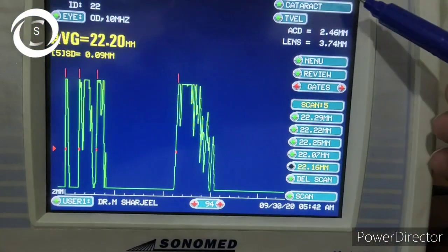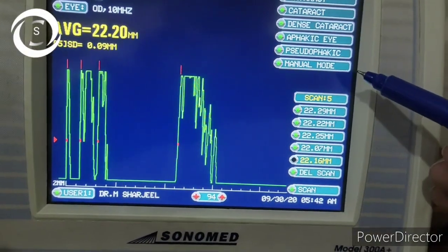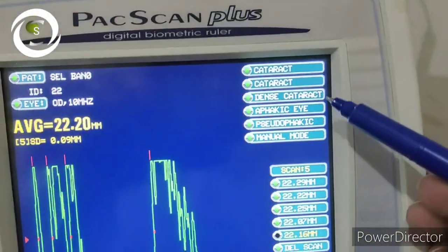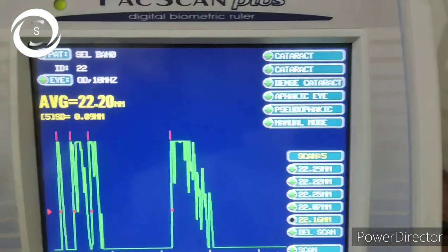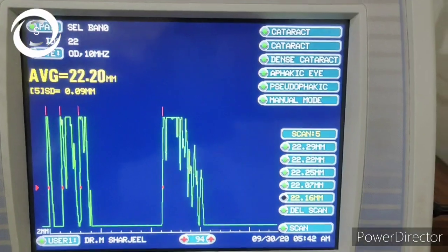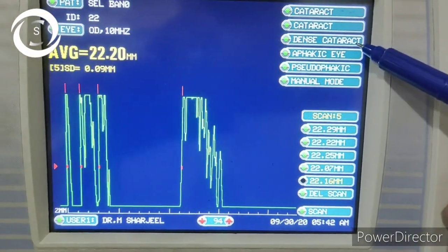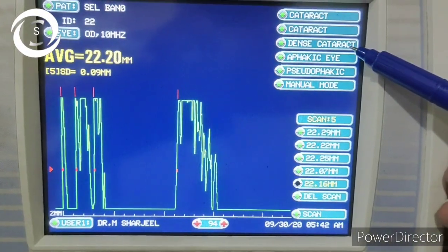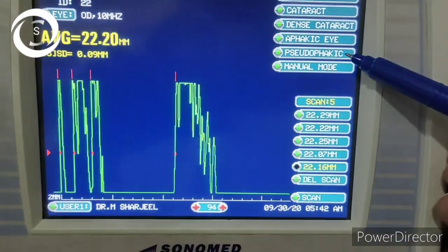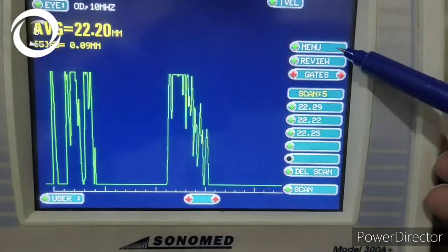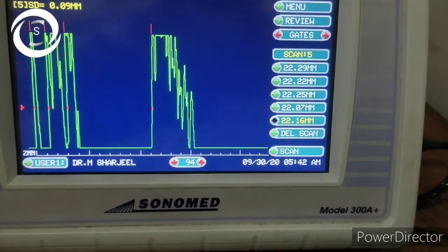Also, if your patient has a very thick cataract, click 'Cataract' and you will have options: dense cataract, phakic mode, and pseudo-phakic mode. Click 'Dense Cataract' and then take the readings.